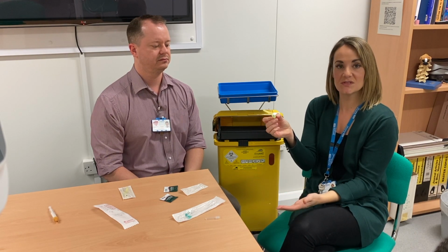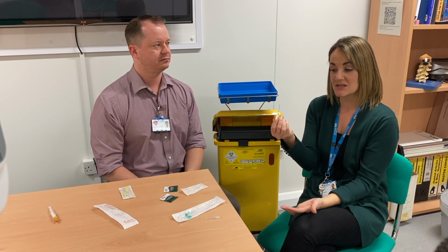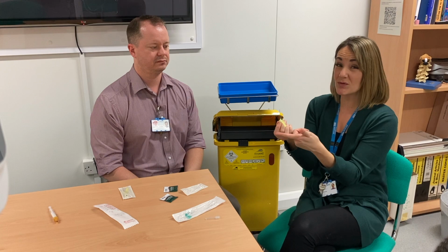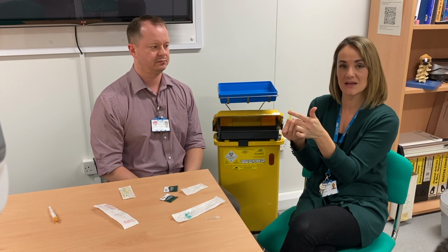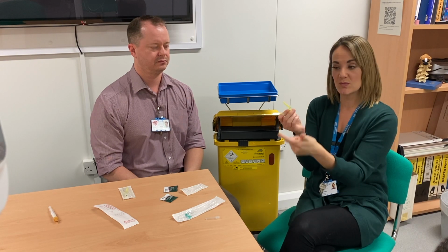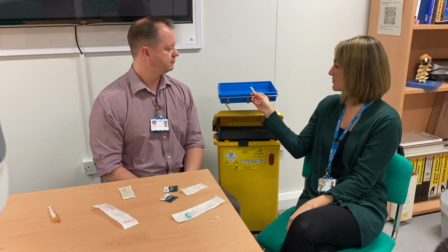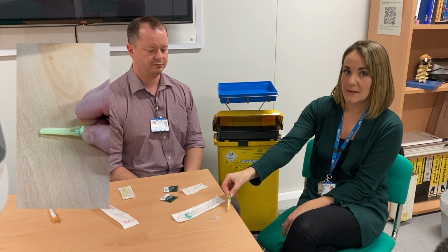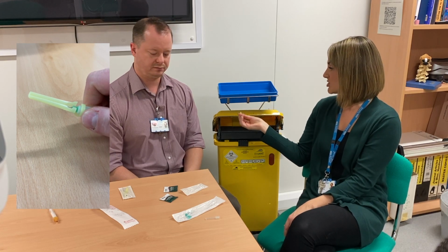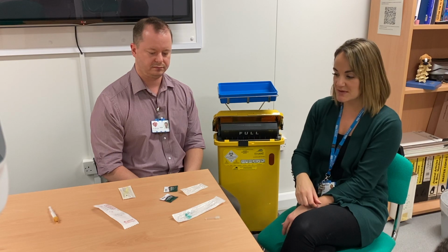So when you've used it to take a blood sample from a patient, it's really important to activate the sharps device, not with your finger, because there's only a bit of plastic, and there have been instances where people have activated it like that and the sharp has gone through the plastic. So activate it on a hard surface, like the corner of the sharps tray, and you hear it click. And as Tom said, straight in the sharps bin, not back in your tray, not on the patient's bed, straight in the sharps bin.